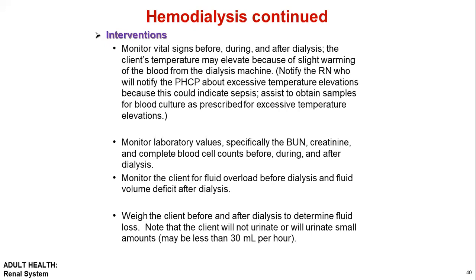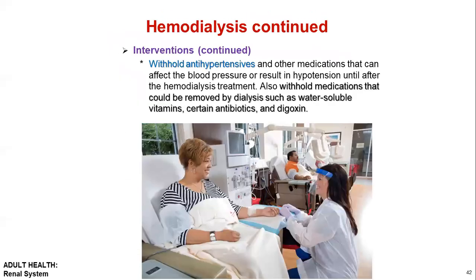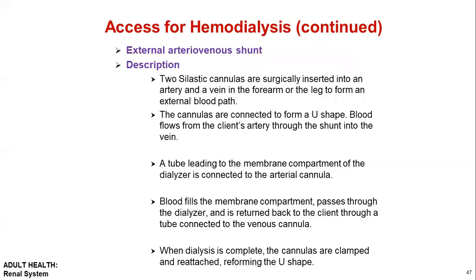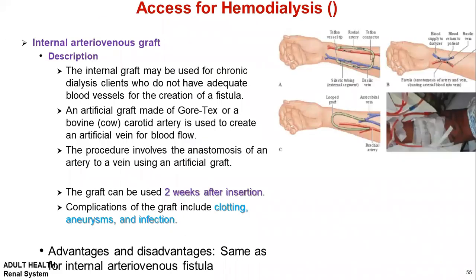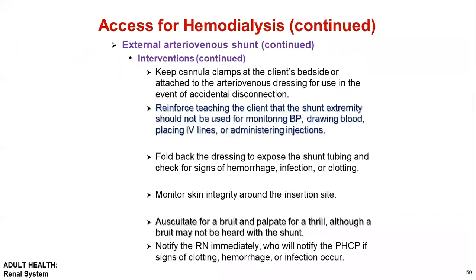So let me read it with you. Monitor the vital signs before, during, and after the procedure or dialysis. The client's temperature may elevate because of slight warming of the blood from the dialysis machine. So, my friend, this is the dialysis machine. I can show you a picture like this.